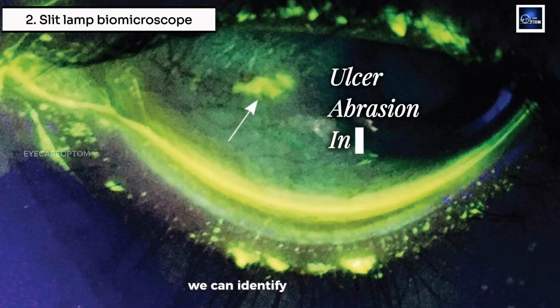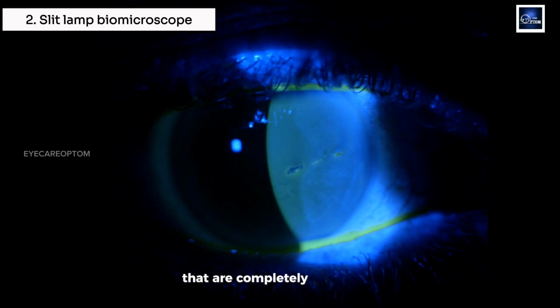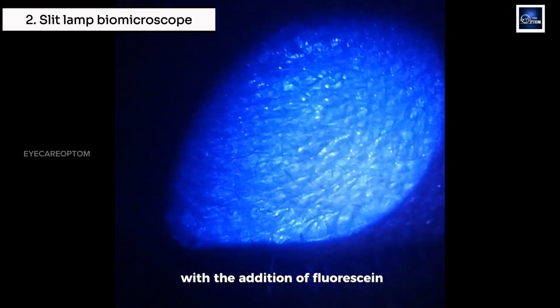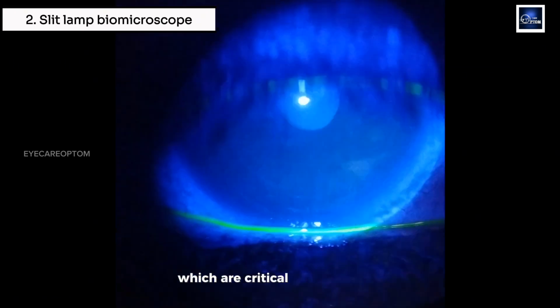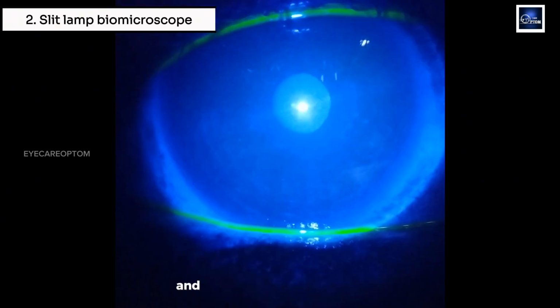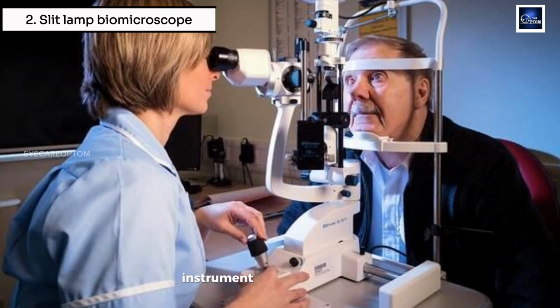We can identify corneal ulcers, abrasions, infiltrates, edema, neovascularization, and degeneration that are completely invisible to the naked eye. With the addition of fluorescein dye, the slit lamp can reveal epithelial defects and staining patterns, which are critical in contact lens practice and corneal disease management. This is the gold standard instrument for detailed corneal assessment.